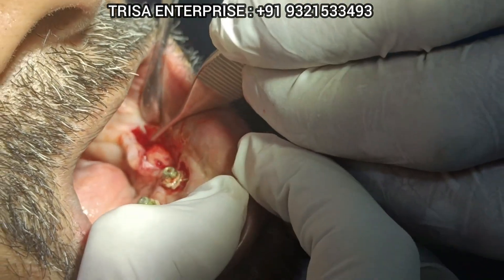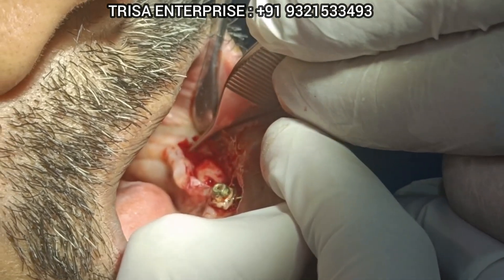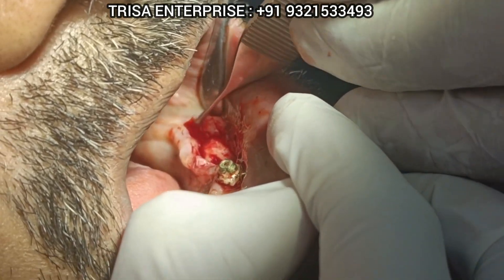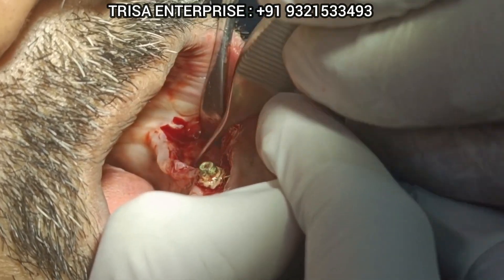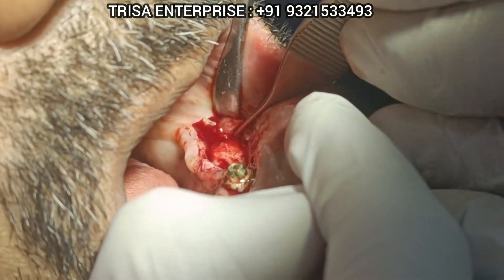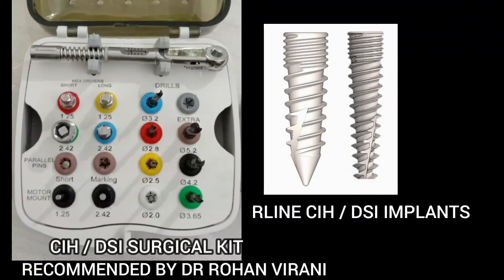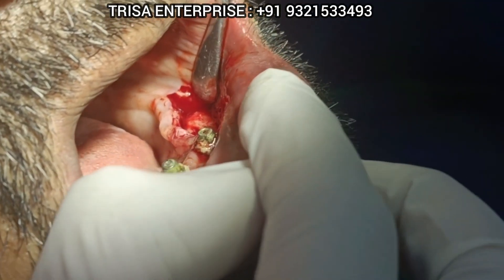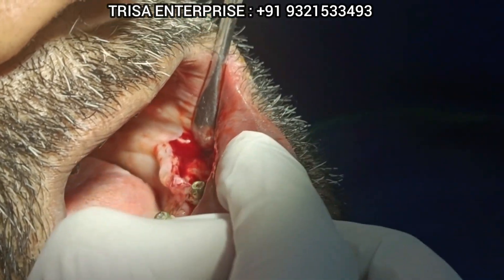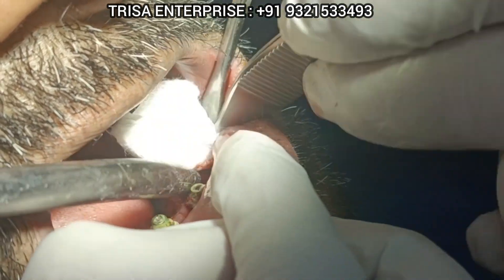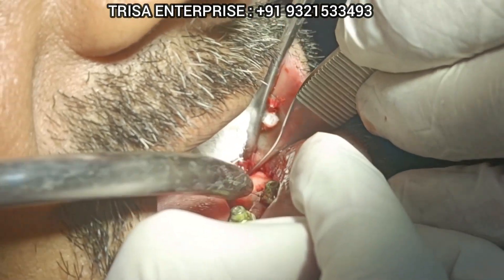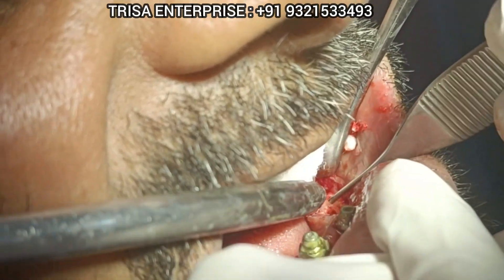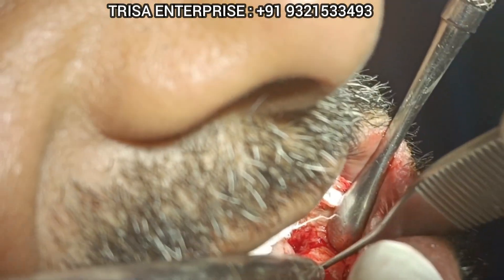For the sake of saving time, I have already reflected the flap. You can see the incision here and two vertical releasing incisions. This is the first rarefaction zone which I showed you on the OPG. This is the second rarefaction zone — and this is the area on the OPG where I want to work.